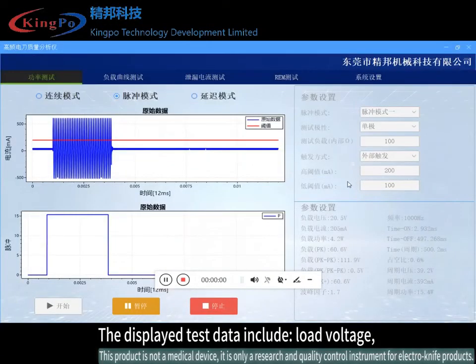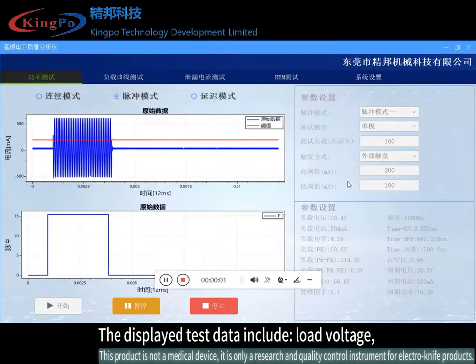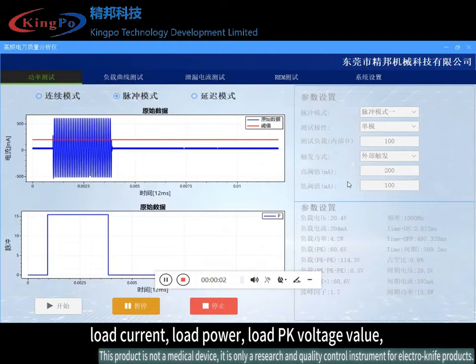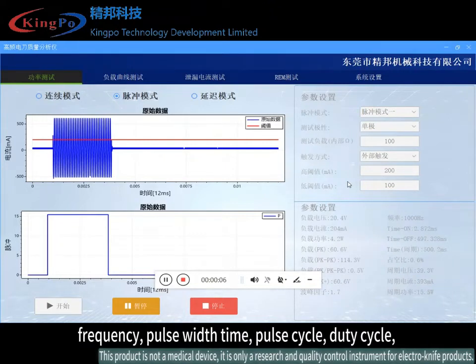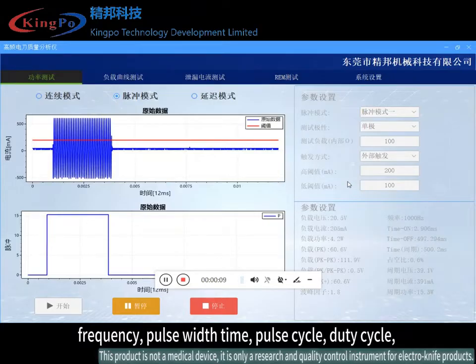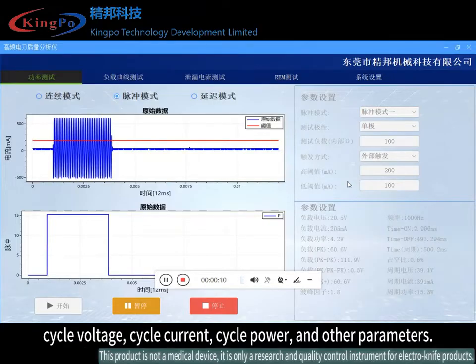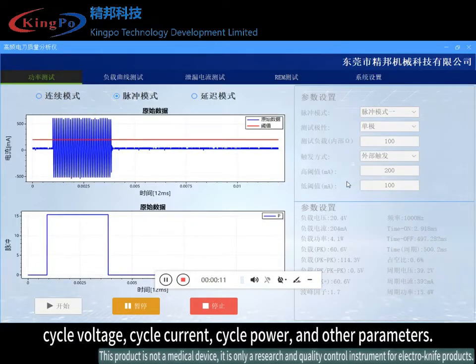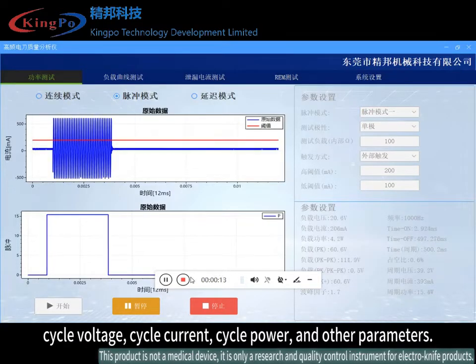The lower right box shows the result data of the pulse signal under test. The displayed test data include load voltage, load current, load power, load PK voltage value, frequency, pulse width time, pulse cycle, duty cycle, cycle voltage, cycle current, cycle power, and other parameters.